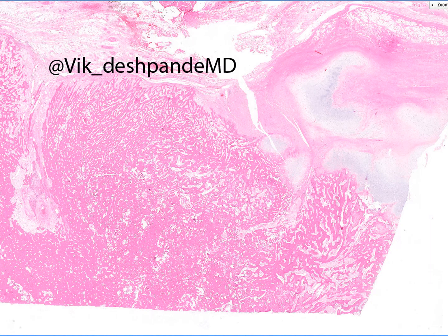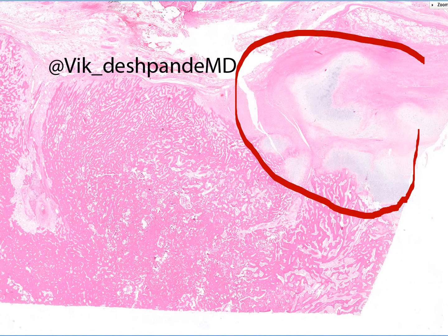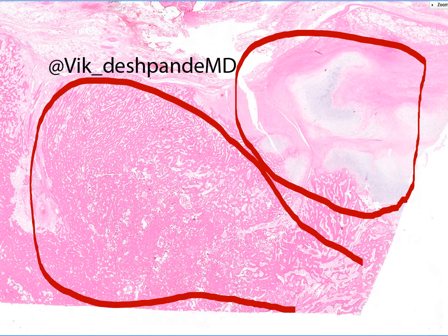Here's a very low-power view of the case. The surface of the lesion is composed of blue material, which is cartilage. The cartilage is actually fairly cellular, as we'll see in subsequent slides. You can imagine a biopsy capturing this area and being tempted to call this a surface chondrosarcoma. Beneath this is a heavily ossified lesion with thick seams of bone separated by relatively poorly cellular stroma.